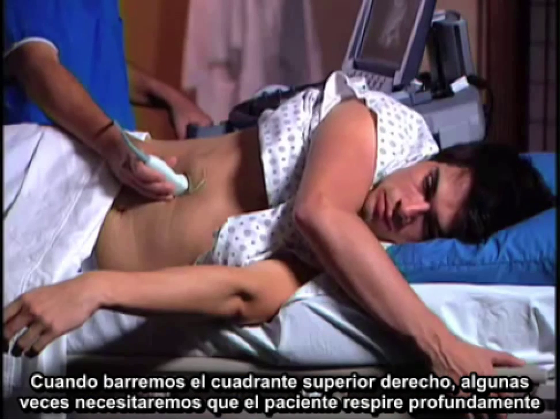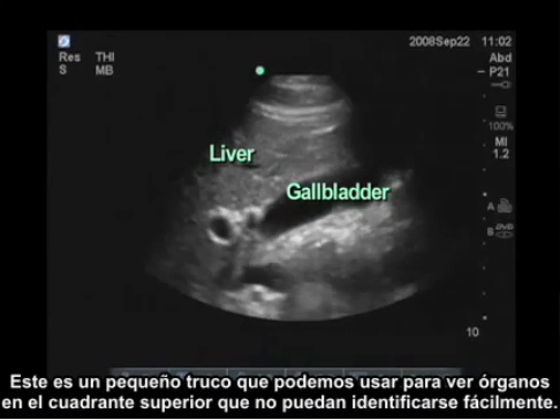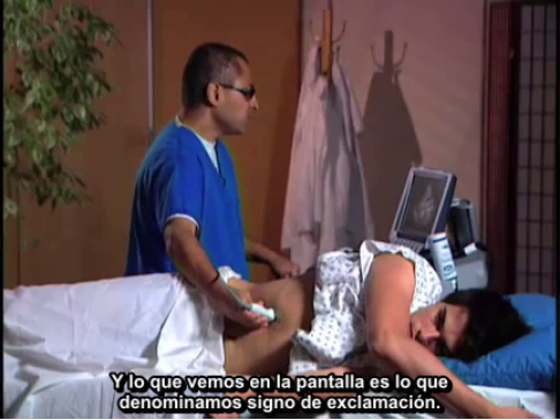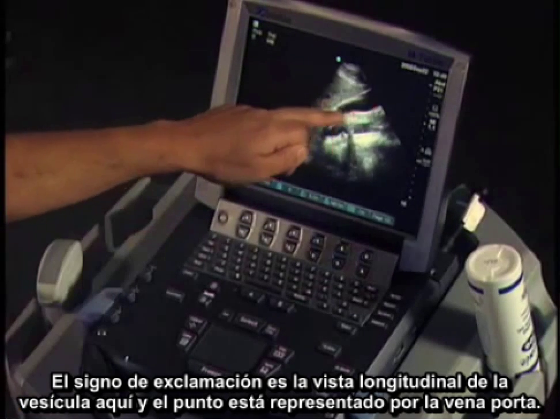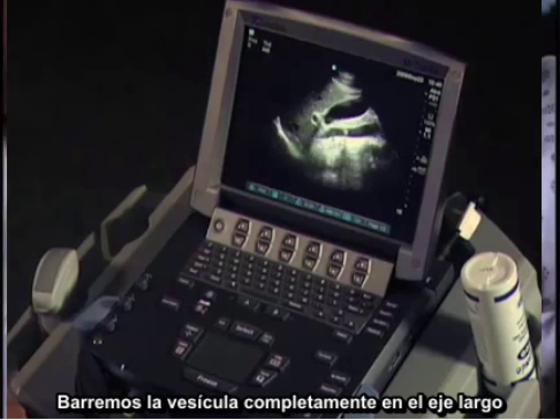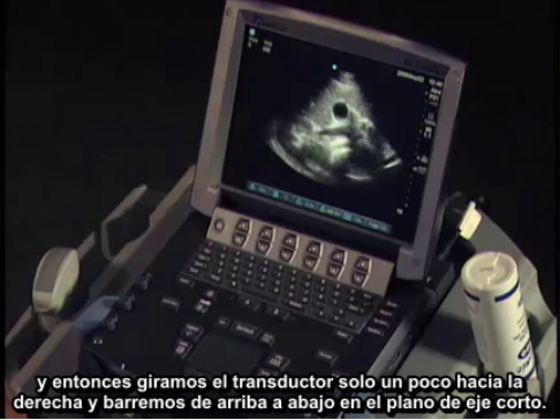When scanning the right upper quadrant, sometimes you'll need the patient to take a deep breath. The liver will be pushed down and the gallbladder will come easier into view — a useful trick for identifying upper quadrant organs. On the screen we see what we term the exclamation sign: the long part is the gallbladder and the dot is the portal vein. Together this is a key landmark. I'll scan through the entire gallbladder in long axis, then turn the transducer slightly to the right and scan up to down in a short axis plane.